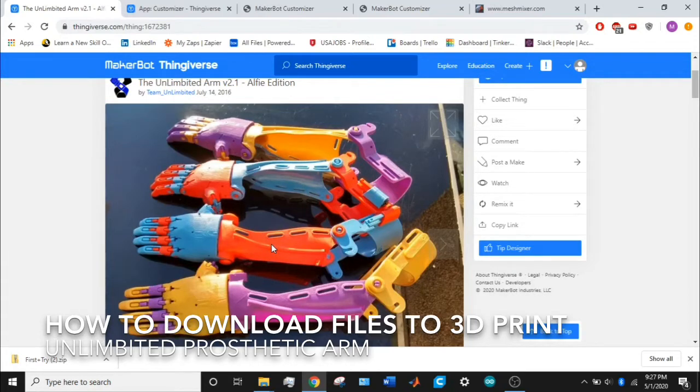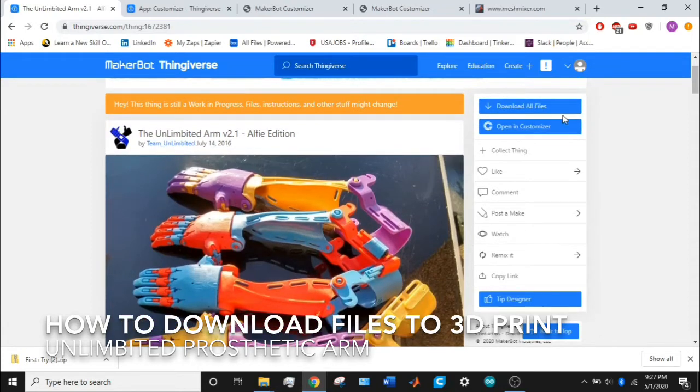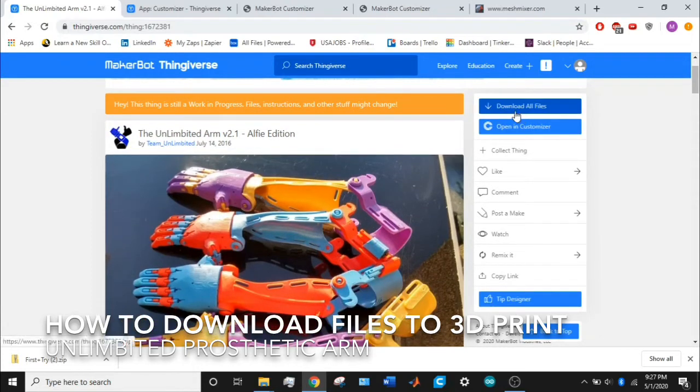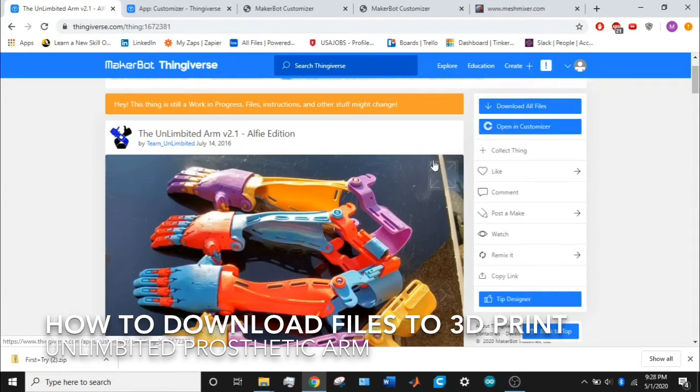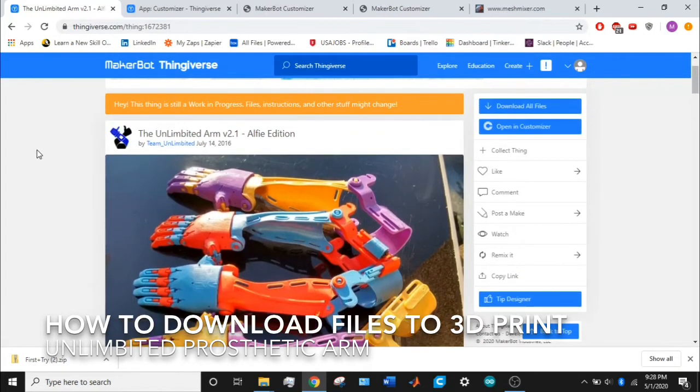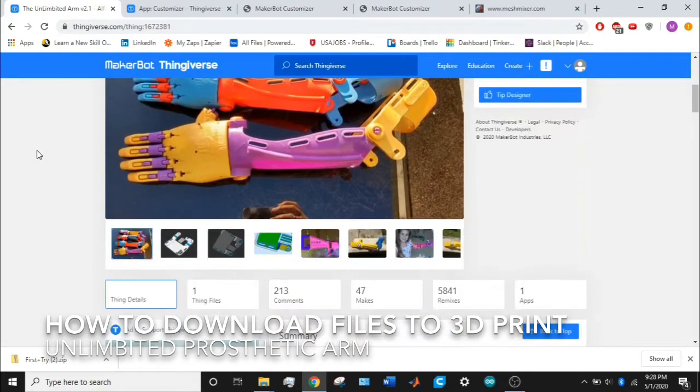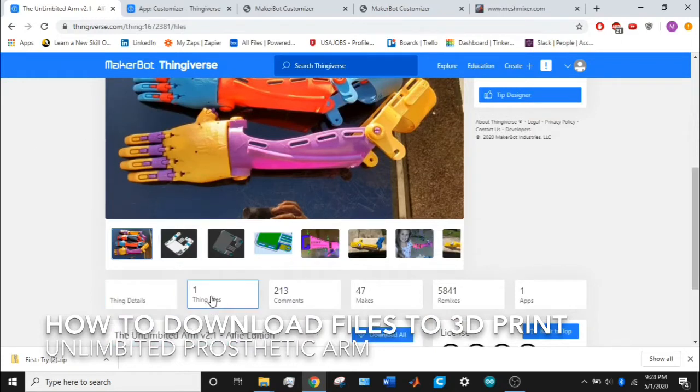This is an elbow-powered prosthetic. Now, there are two buttons on the right side: download all files and open customizer. If you click download all files, you'll download files of the default size. If you want to see what files you're downloading, scroll down below the photos and click thing files.